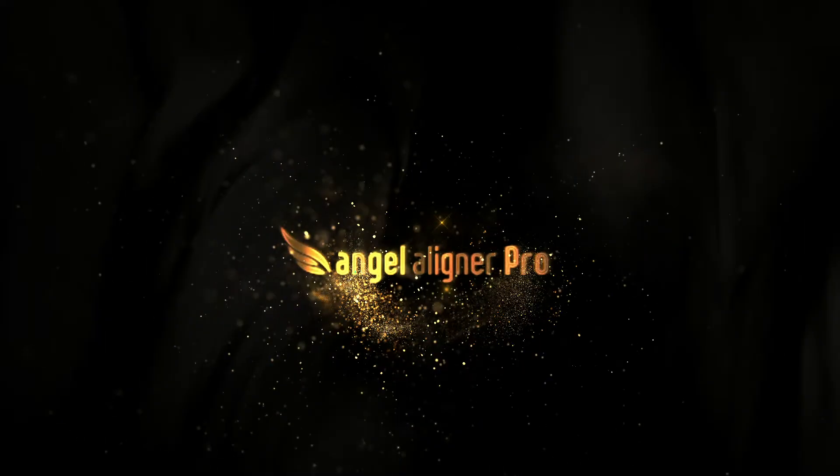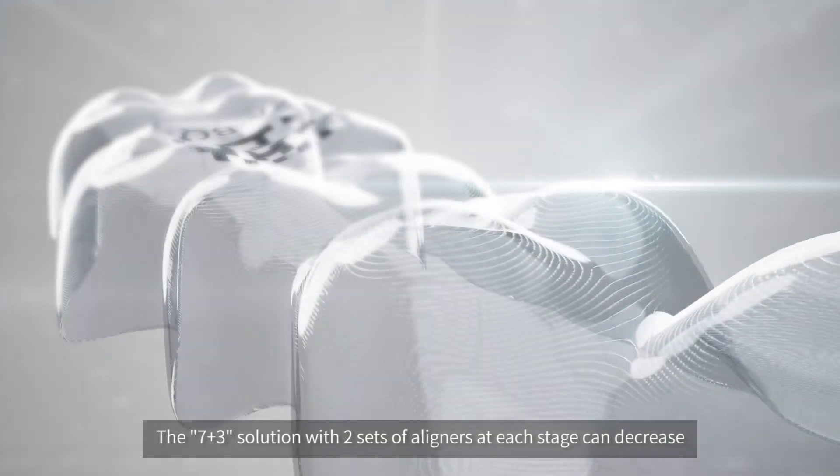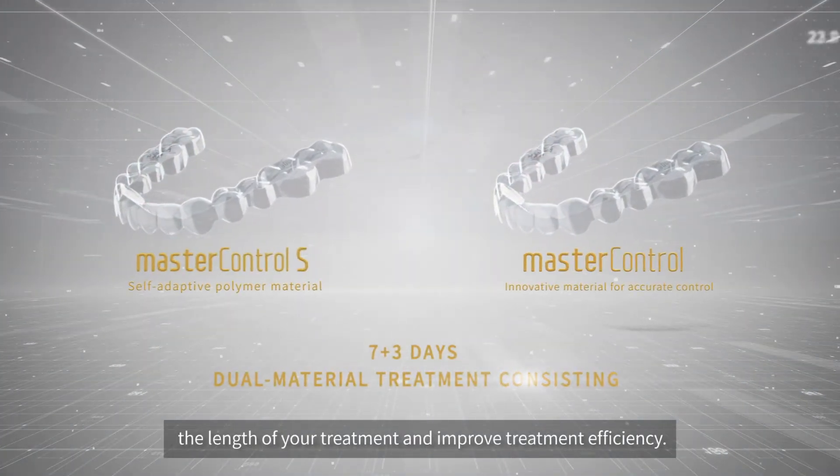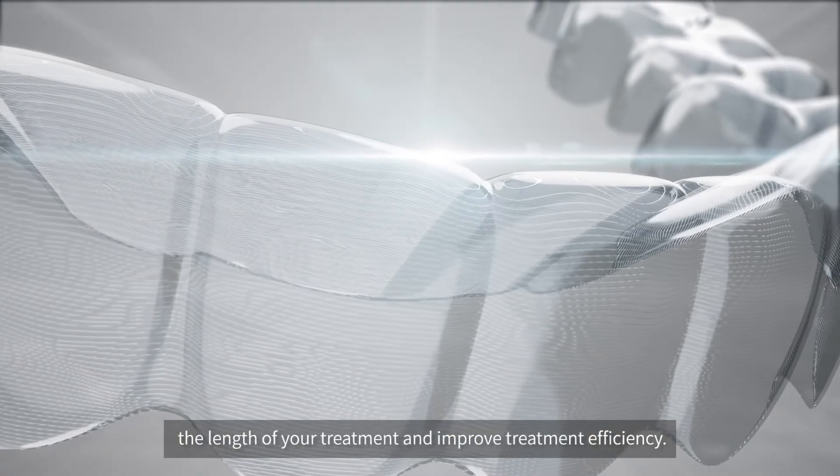Angel Aligner Pro. The 7 plus 3 solution, with two sets of aligners at each stage, can decrease the length of your treatment and improve treatment efficiency.